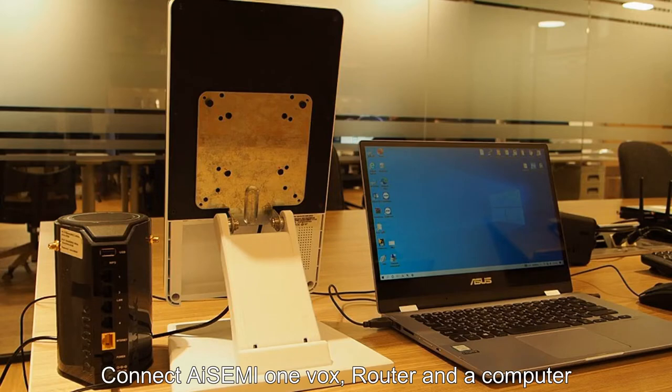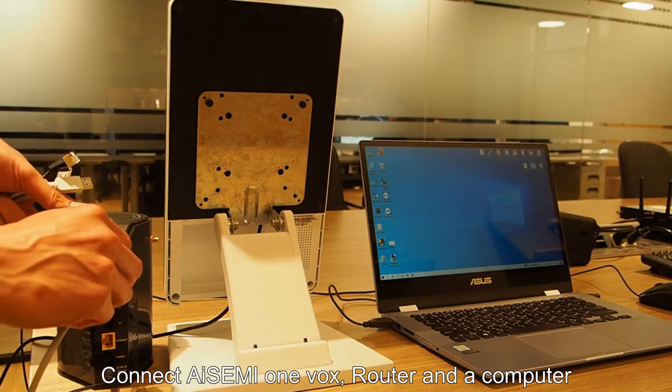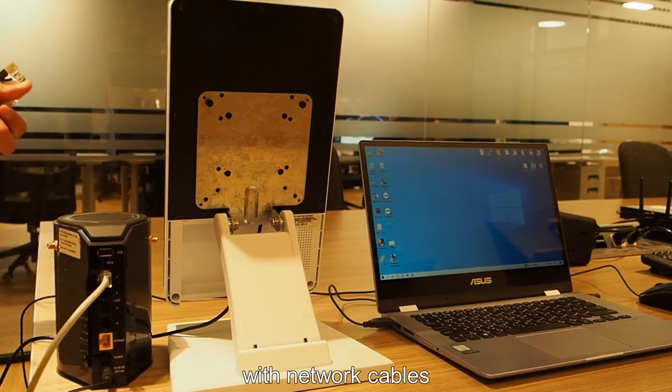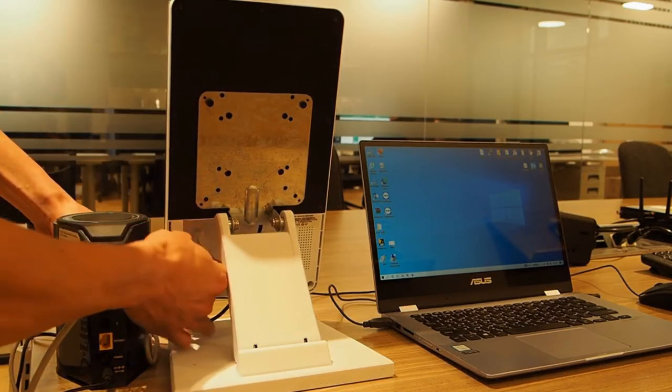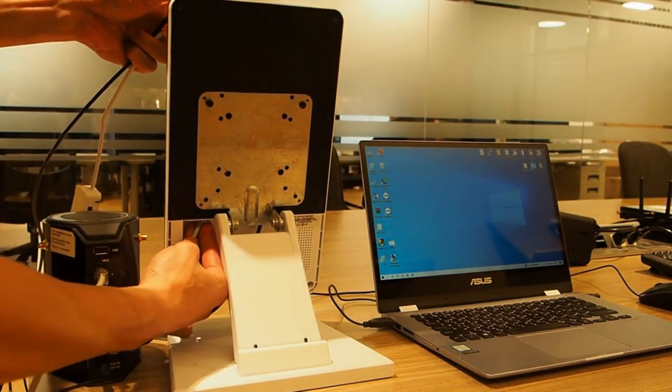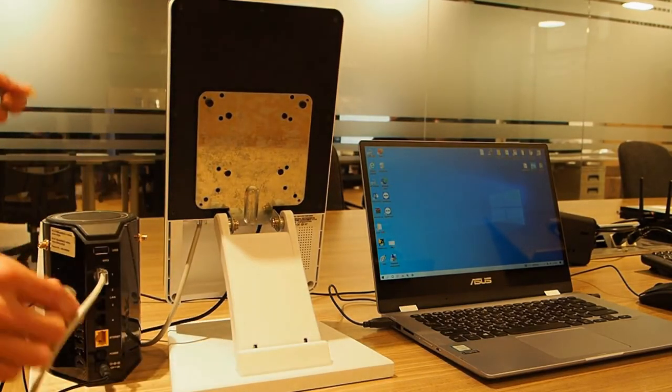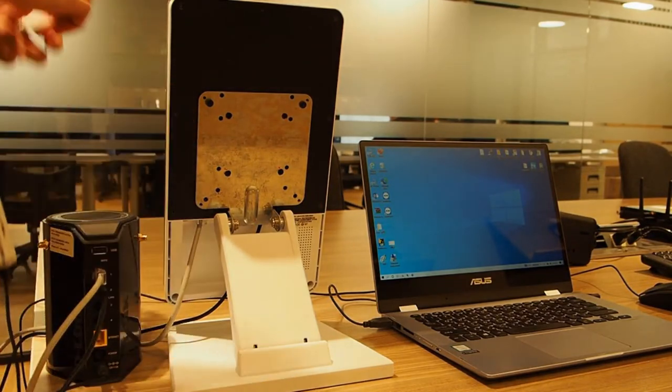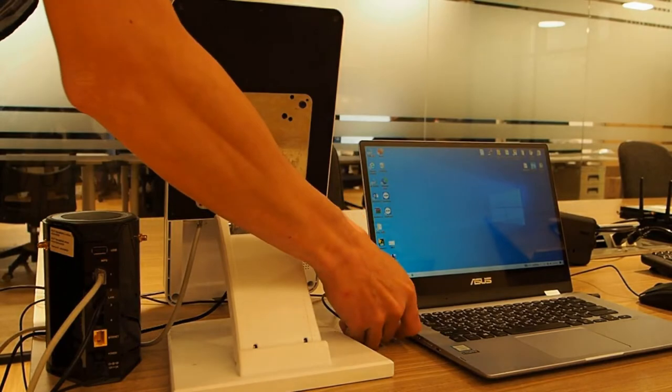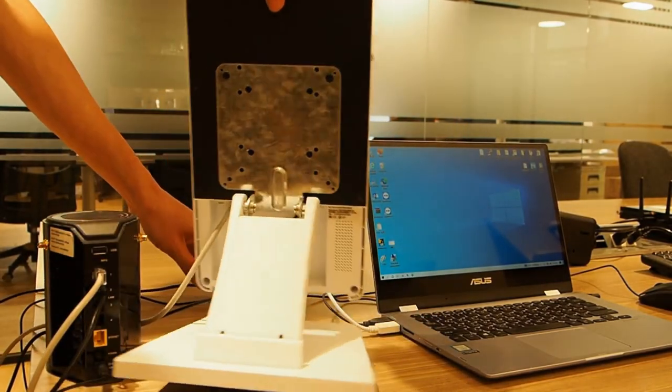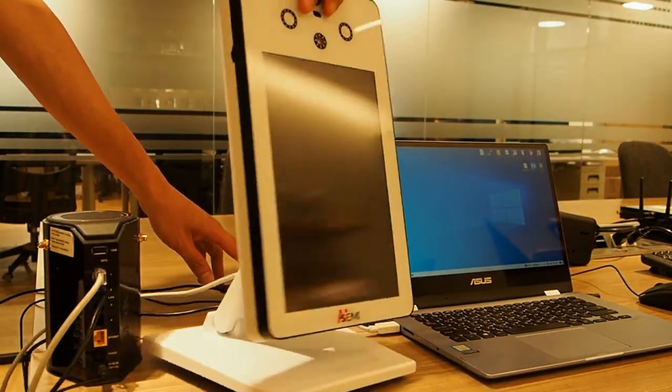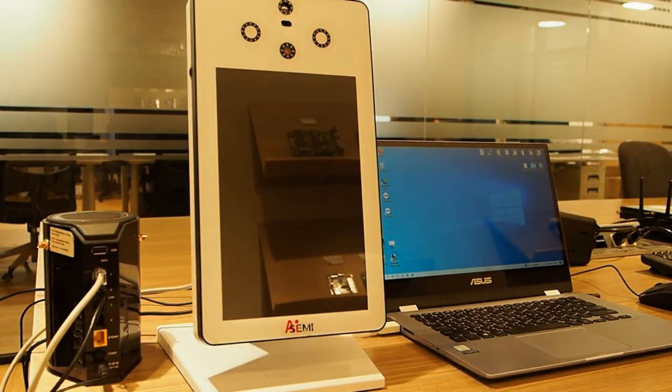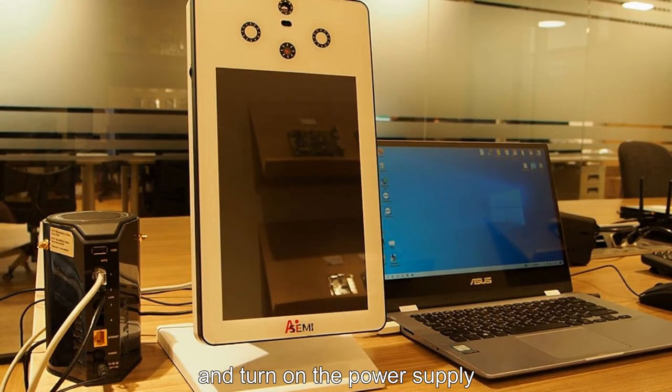Connect AiSEMI one vox, router and a computer with network cables and turn on the power supply.